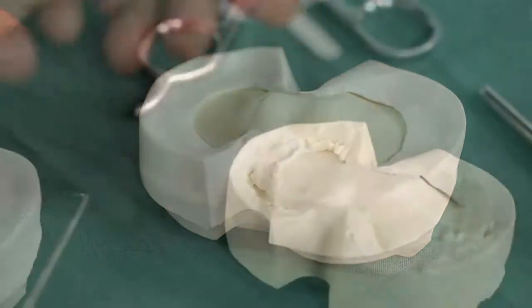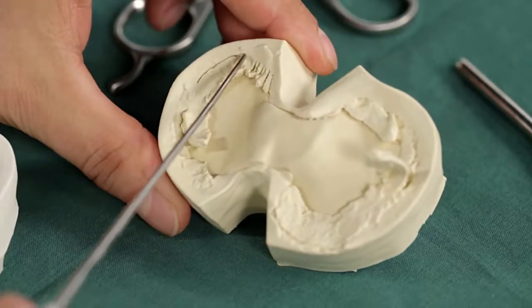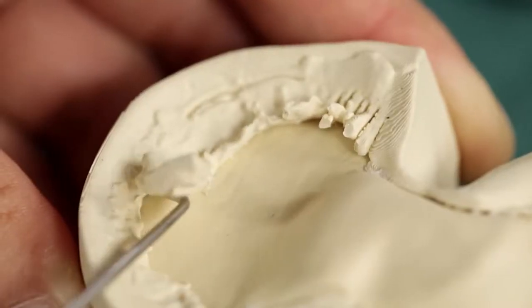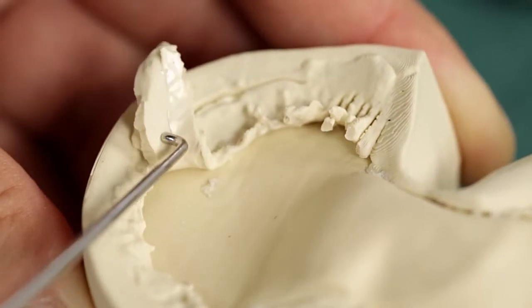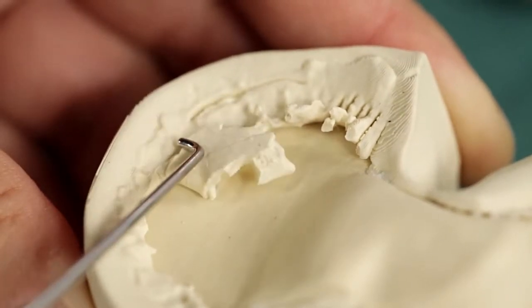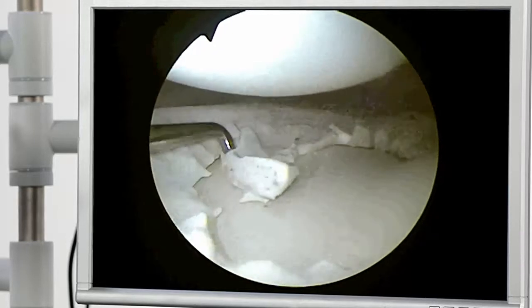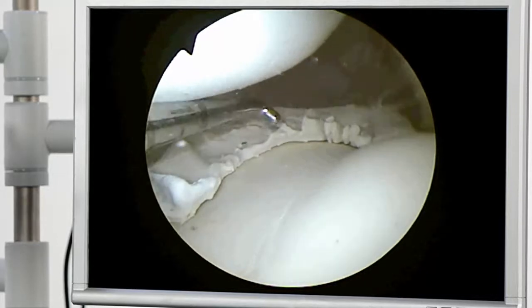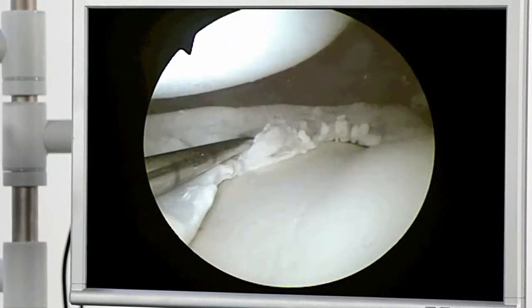Healthy menisci and cartilage can be diagnosed and operations can be performed on damaged areas where simulated. The material is easy to add in with the modular click system. The meniscus insert — in this case placed as damaged — can be subjected to a thorough bimanual examination.